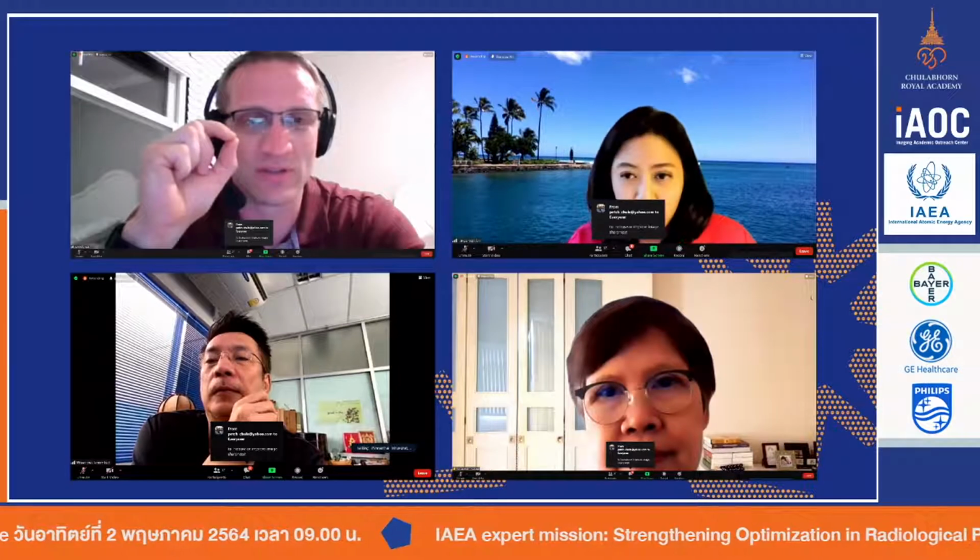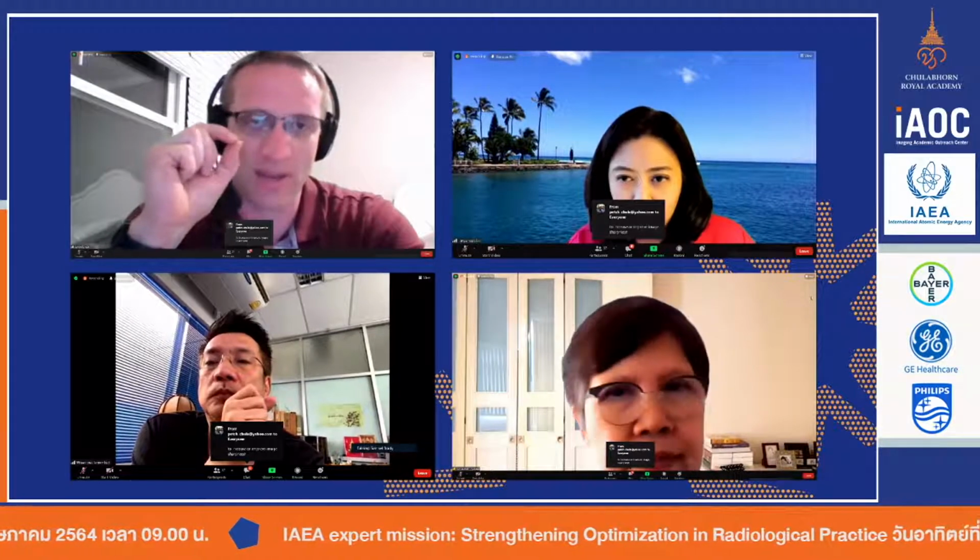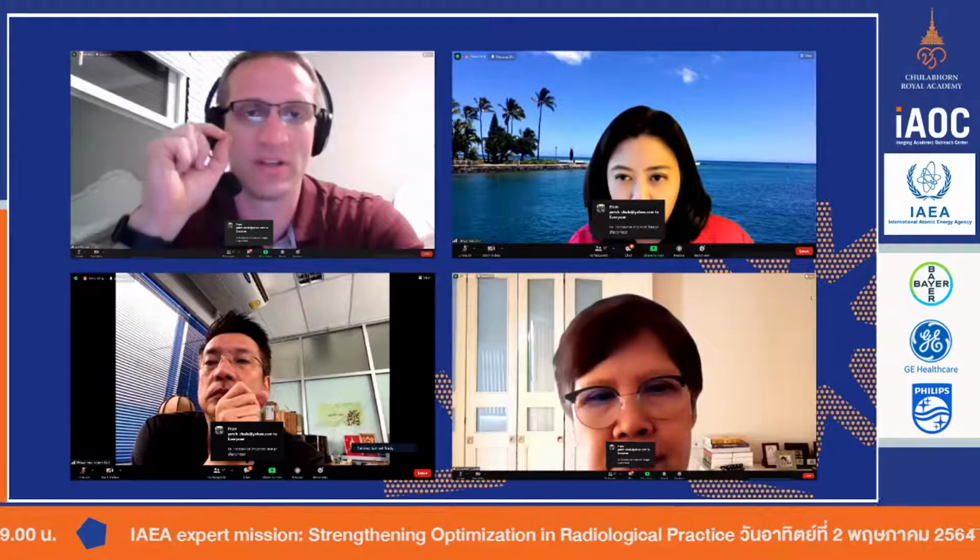But here, what I'm hearing from you is you really want to see the vessels, and you want to get good resolution. So my comment is make sure you have a good grid in. The technique factors will be just your normal technique factors, because you're not imaging through glass. I'm guessing you're not imaging in any weird situation. They might be in a bed, they might be in a chair, like a wheelchair. So go back to the basics, the fundamentals, the basic standard, because patients in a field hospital are usually young. This time they are young and asymptomatic. They can help themselves.